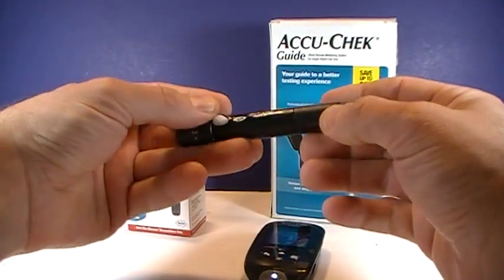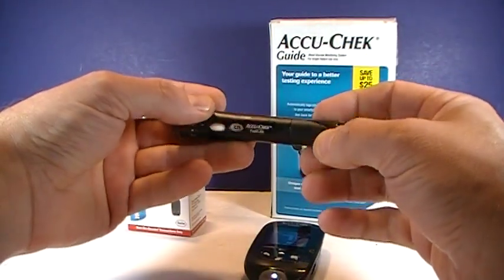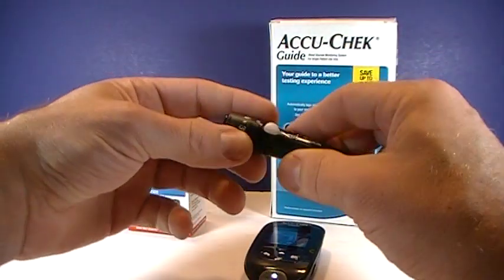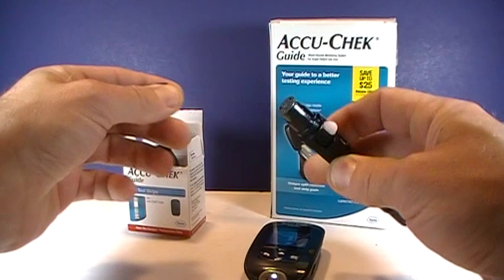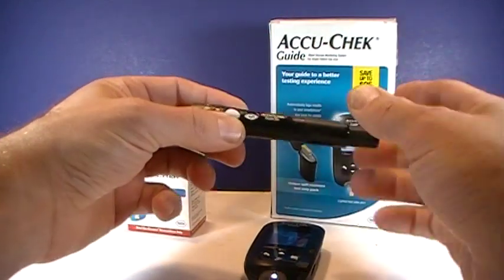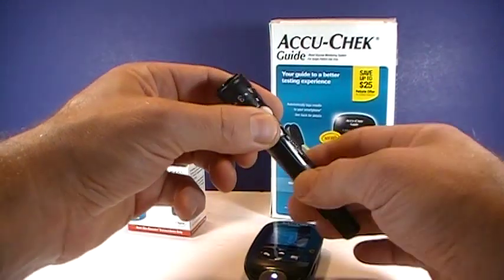We have the AccuCheck S-Click lancet device. I have a separate video showing you how to load that, but essentially there's a drum with six lancets that you load into there, and you can poke yourself six times to perform your glucose test.